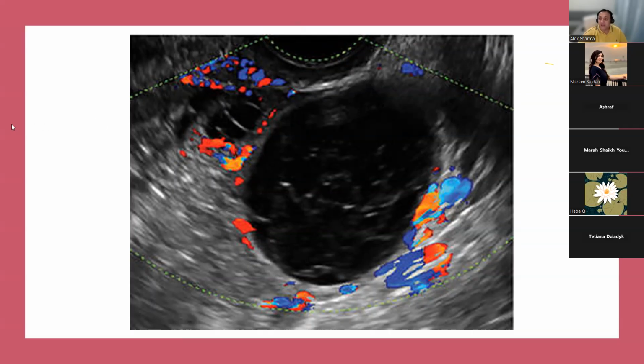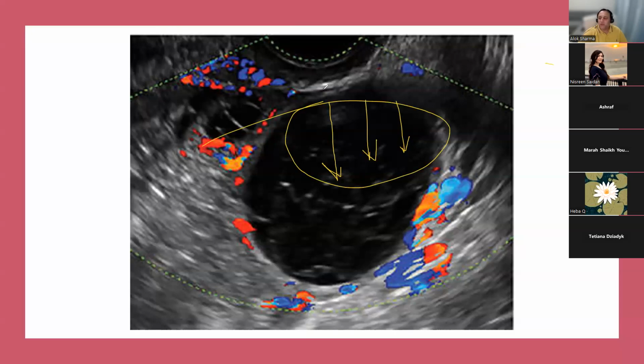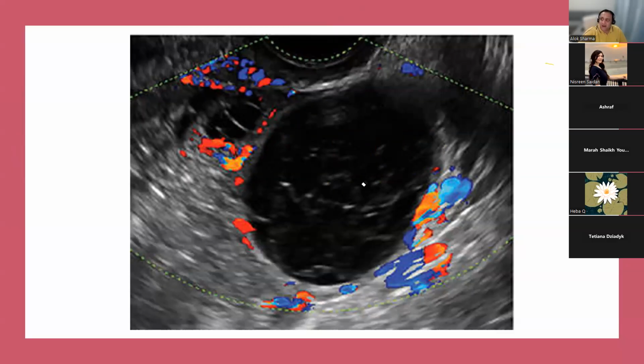But there is actually no change in density all the way. So the acoustic impedance here is constant. So sound waves will now move at a constant propagation velocity. If there's no difference in acoustic impedance, there's going to be very little reflectivity. So some of these sound waves will reflect back. The echoes will be weaker. Again, as we go into tissue, we lose energy. So what you find from our perspective is this large anechoic structure, and it gets darker as the sound waves go in.